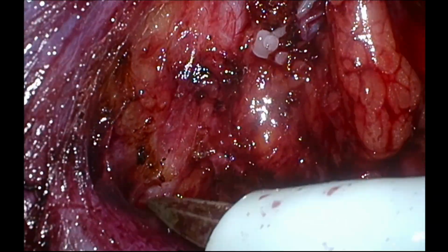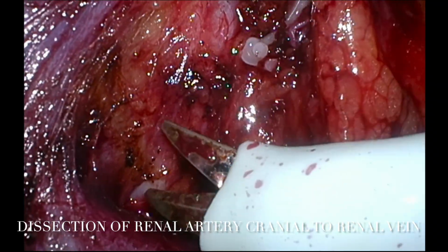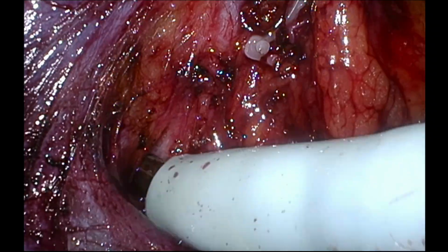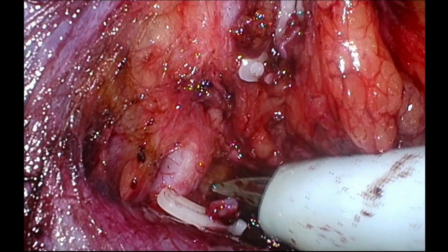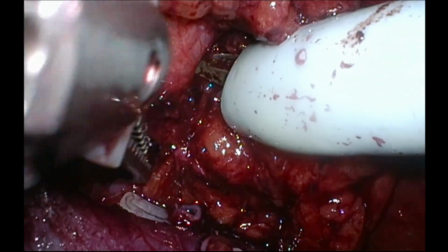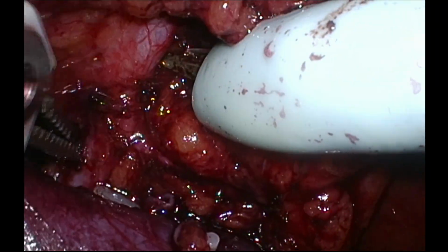In this patient, there were two renal arteries. One can appreciate movement of the scissor and bipolar along the axis of the renal artery. This prevents any inadvertent injury.